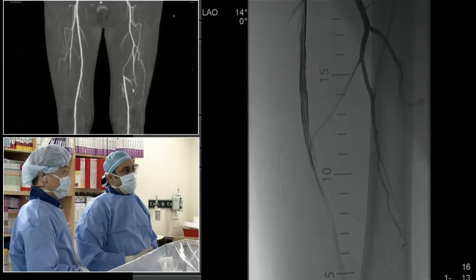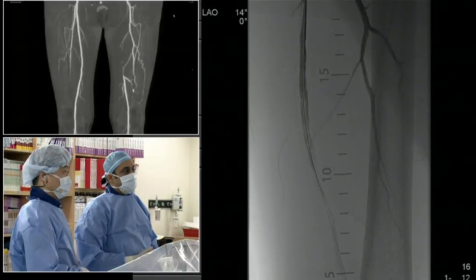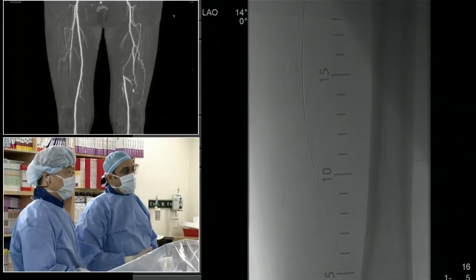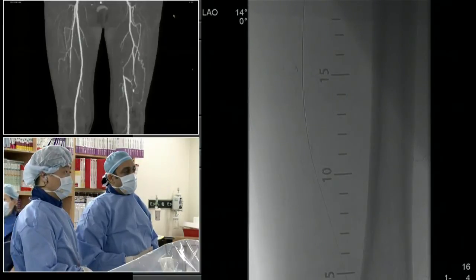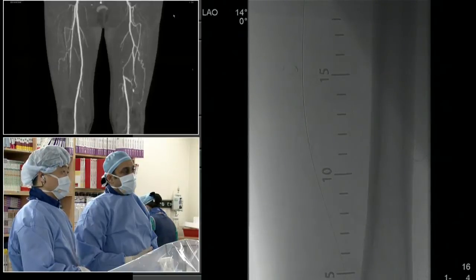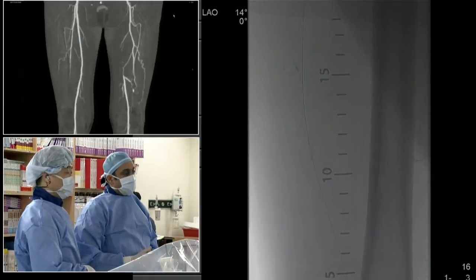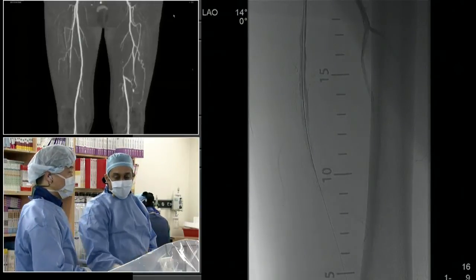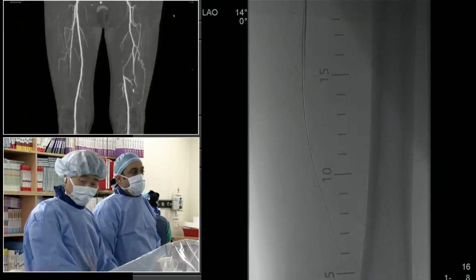And here we would hedge your bets. You could stent just the outflow, which is where the challenge is. Sure. And then just do balloon angioplasty to the rest of it, or run the whole thing with drug-eluting stent up to the portion that's proximal to the SFA and then just do balloon angioplasty there. Again, I think it would be really nice to have the data set from DEFINITIVE AR to know what drug-eluting balloon did with atherectomy here.